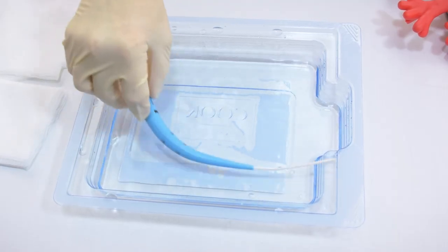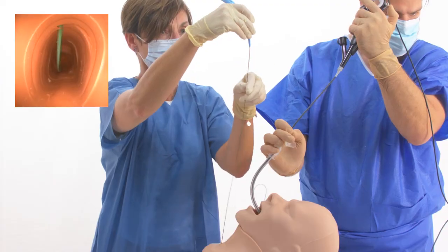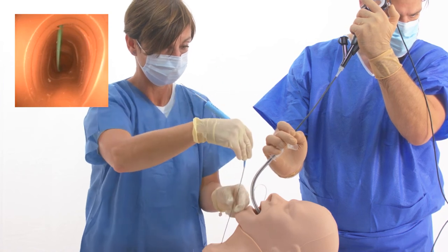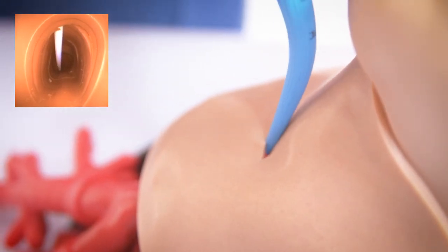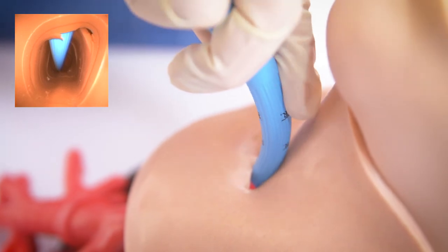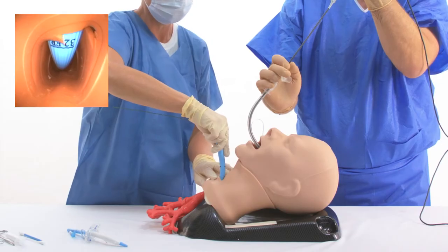The Blue Rhino Multi-G2 dilator is immersed in water and advanced over the wire guide with its guiding catheter as a unit. The dilating assembly is advanced and pulled back several times to effectively dilate the tracheal access site.